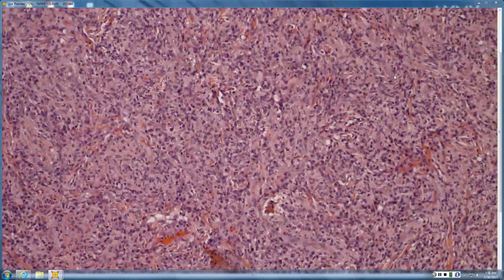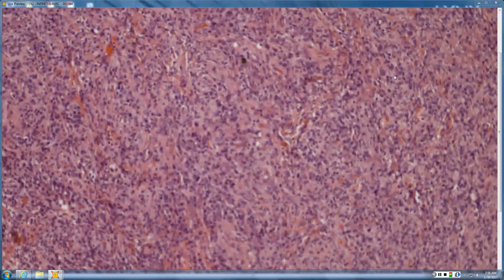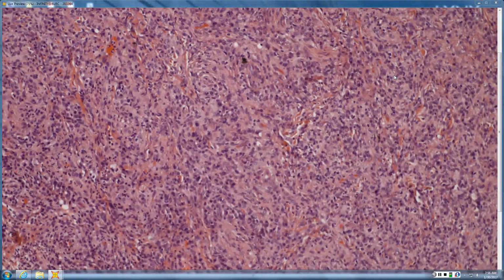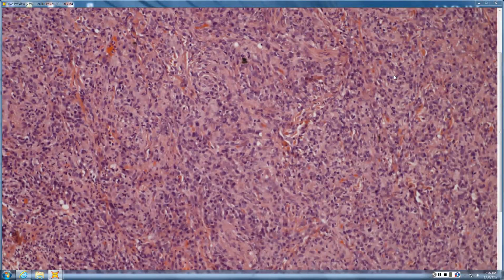Could definitely be. Get an AFB. Yeah, so definitely get an AFB. Think of atypical organisms. Think of fungal. Think of acid fast. You've got to think of syphilis, and this would be a gummatous lesion of syphilis, which is just granulomatous syphilis. And by history, that was exactly what it was, gummatous syphilis.